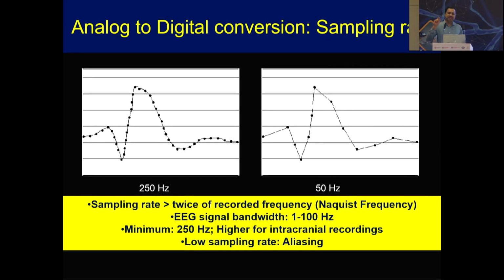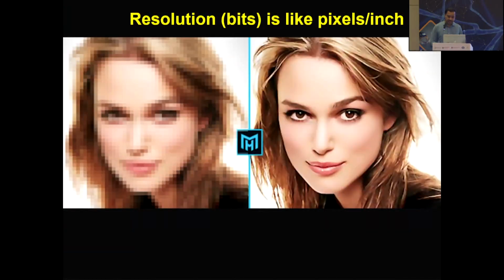So when you ask for the machine, the sampling rate should not be modified when the machine is installed. That is the important thing which we need to keep in mind.